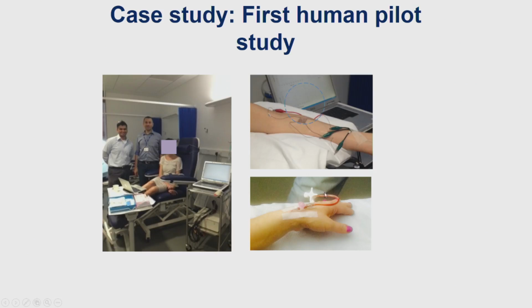And then again, you need a gold standard there as well. Your gold standard is going to be one of the things that is normally used in a clinical lab. That's your IV cannula here. The IV cannula is to draw venous blood. So you're drawing venous blood every half an hour, every 1 hour. You can't do that regularly, otherwise you can drain the person of the blood. So you're drawing blood every 30 minutes, every 1 hour, and then you're putting it into a YSI machine, which is used for measuring glucose in the venous blood. Right? And that machine is actually a gold standard. That machine is very well equipped to give you accurate and precise results.